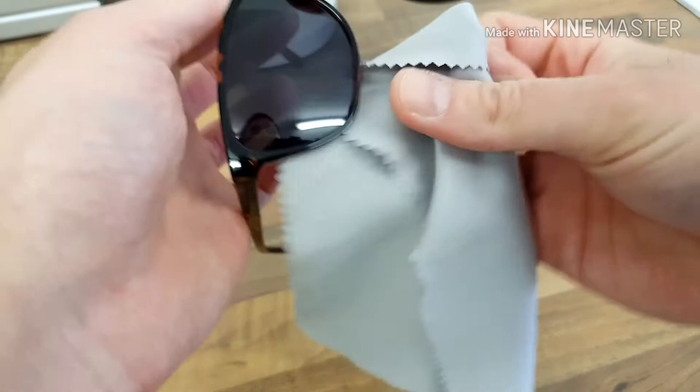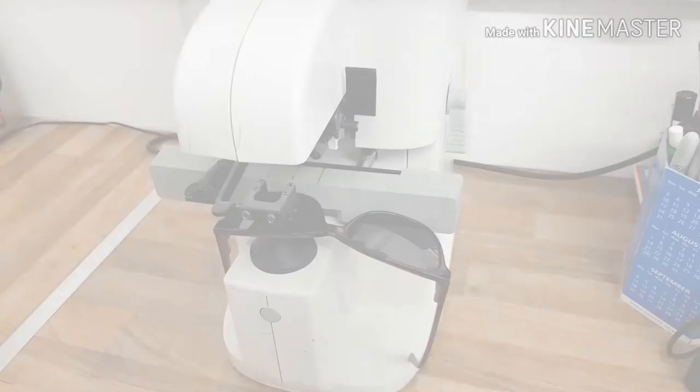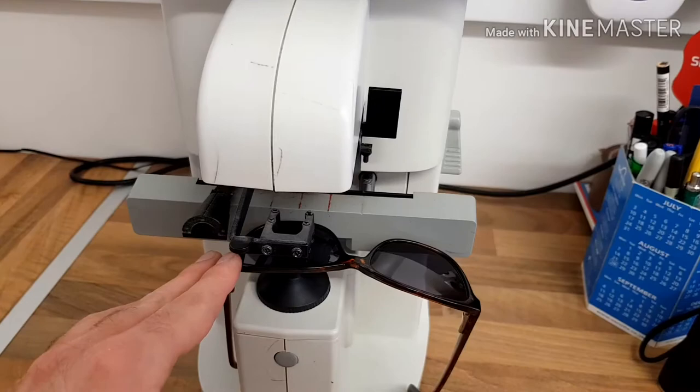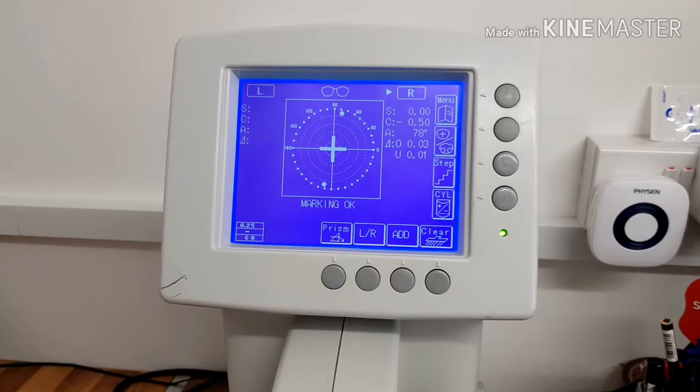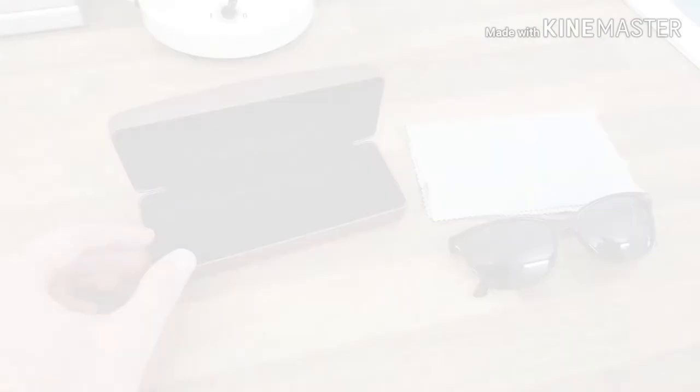We'll be checking lots of different measurements and other things, and then they should be good to go. So your glasses will be going into a machine like this, and then this machine will read the power and everything that we need to look at on the lenses. Obviously I can't show you the customer's details, but that left lens there is absolutely fine. Then we'll move over to the right and then it's going to be ready to go. Everything's all done — that's pretty much the whole process. They're all good to go, and that's the whole job done.